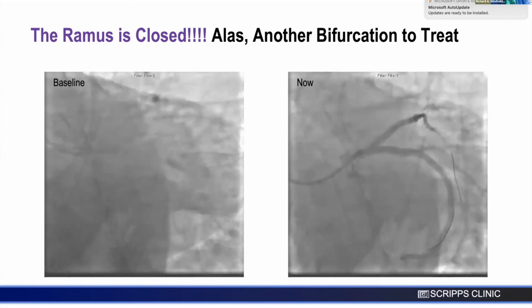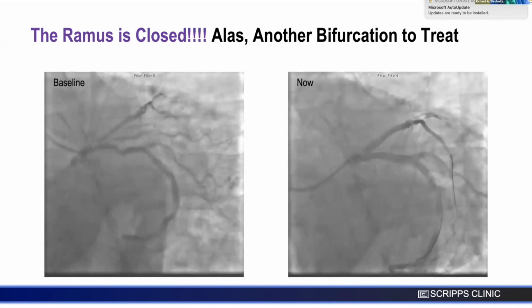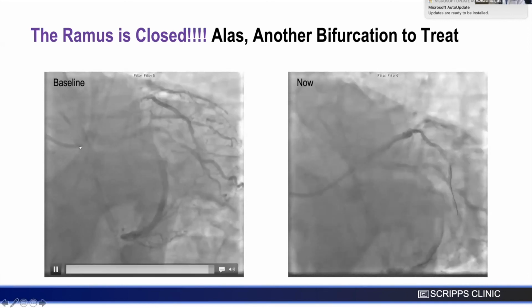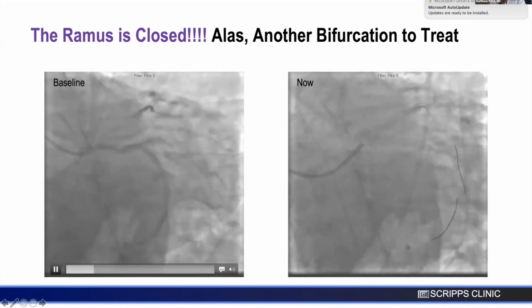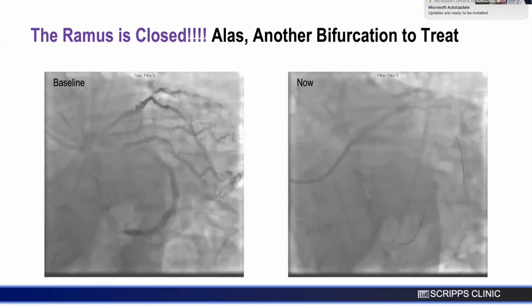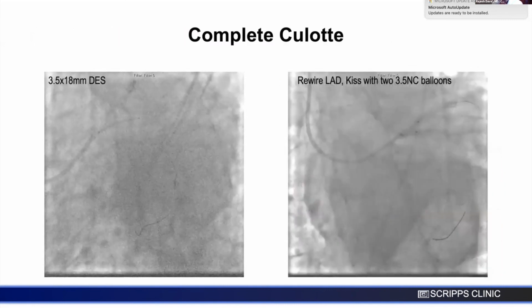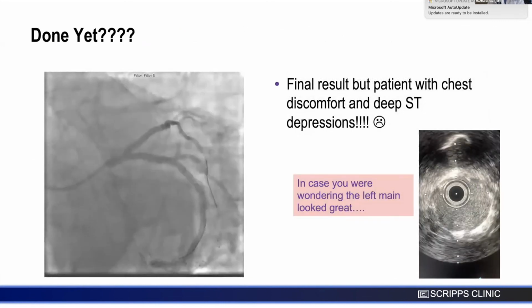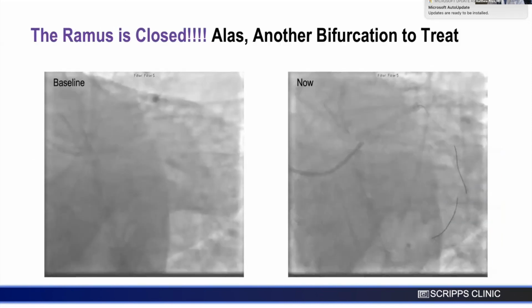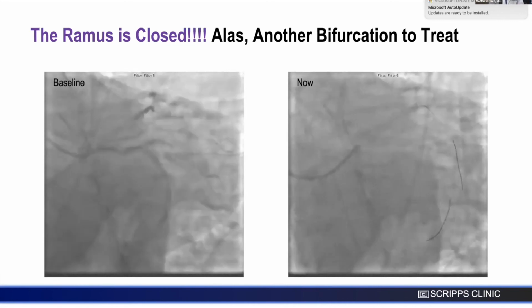But didn't you have a stent in the LAD to the left main initially, and then you took a stent from the circ back to the left main? So you had a double layer where the ramus was, no? No, because the circ stent ended just past the ramus. So I closed the ramus when I put in the stent from the left main into the circumflex. I don't think it's a true ramus. It's just a high, proximal side branch, you're right. It's a high-rising OM. I apologize for that. You are absolutely correct. And so that's why there's only one layer. Okay, that makes sense. Oh my God, you're right. I'm sorry, talking too quickly.